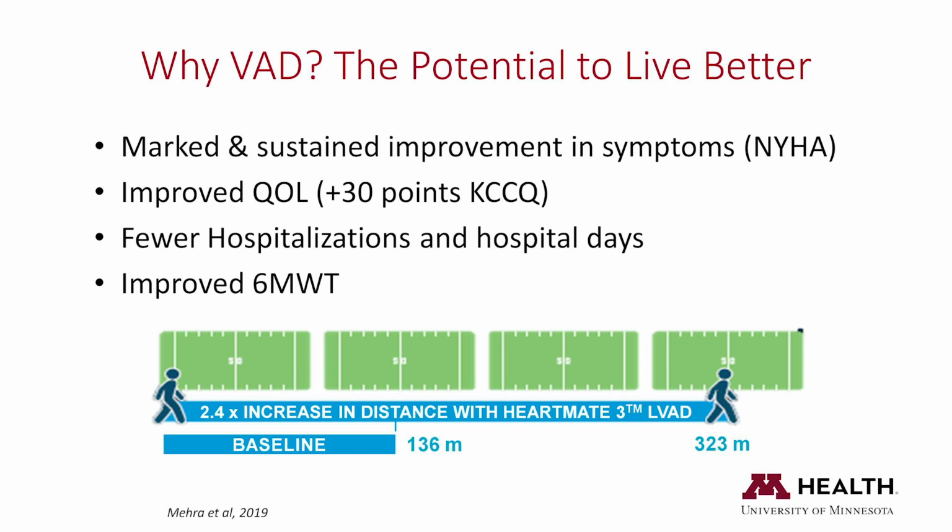So all of you that raised your hand that you remember the XVE, do you remember we thought of VAD as like this last-ditch effort? And we were crazy. Remember when people walked around the hallway with their VADs? This giant machine, like it was big as this podium? Look how far we've come. This is remarkable data, and if you don't put VADs in and you've been discouraged about VAD data and thought it's just a horrible course, you have to be reassured by this data that it's worth it.